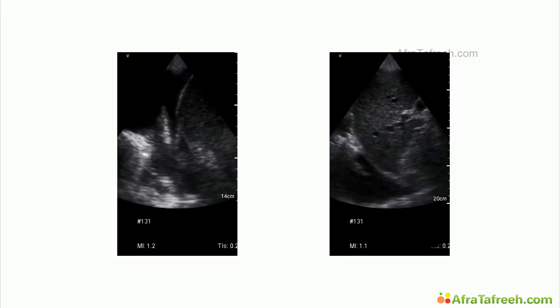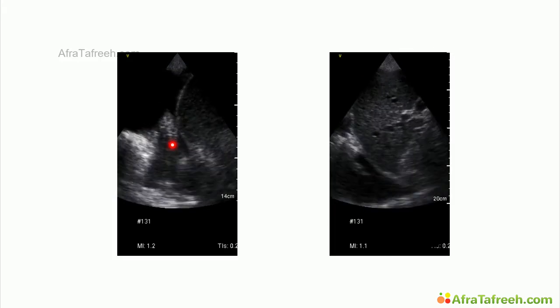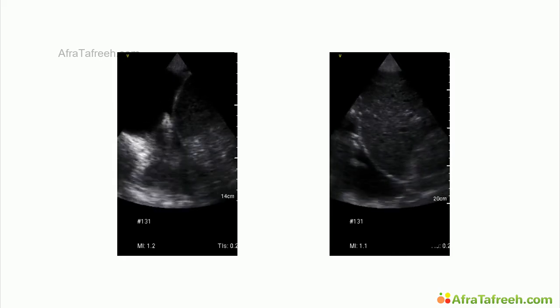But because of his dyspnea, I started with a point-of-care ultrasound of his lungs. And I was not surprised, as you can see here, already pleural effusion present on the left side with atelectatic lung tissue, and on the right side, pleural effusion too. I asked him for how long did he take those painkillers. He stated for several years now, even daily.